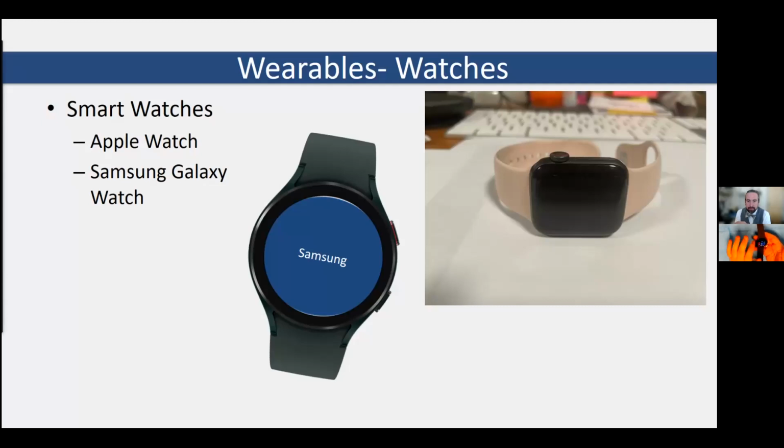we have a variety of different apps that we can access. Everything from basic fitness tracking. We can also pull up the ECG. It walks you through how to perform an ECG exam using the sensors on the back. There's a pulse oximeter, an ECG, and a heart rate monitor in there as well. Oh, this one keeps locking.